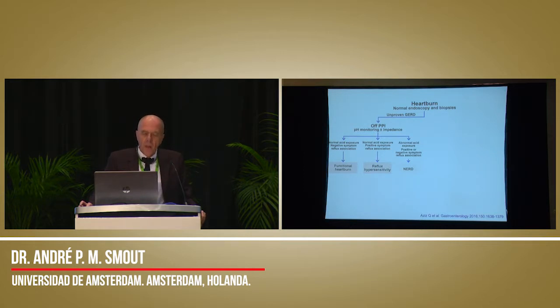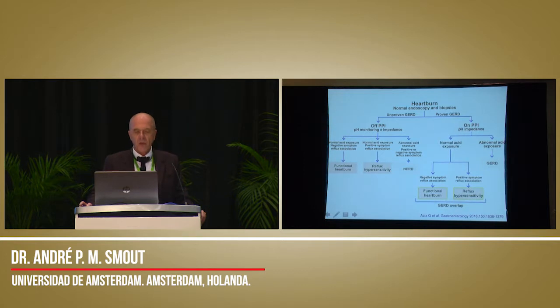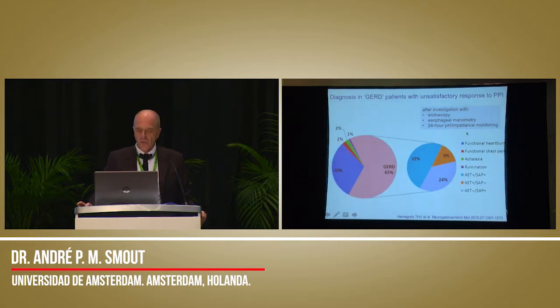Now, the most recent guidelines say that you should use off PPI when you have not yet proven that it is GERD, but when there is proven GERD, that you should use on PPI. We don't fully agree with this. If you have proven GERD or think you have proven GERD, then you're still free to do it off PPI, and you will still have a better chance of finding something.